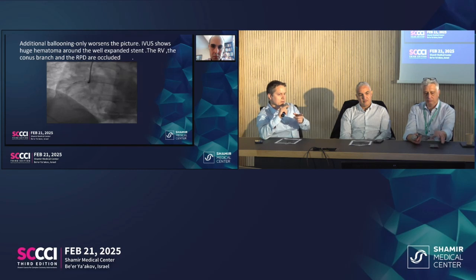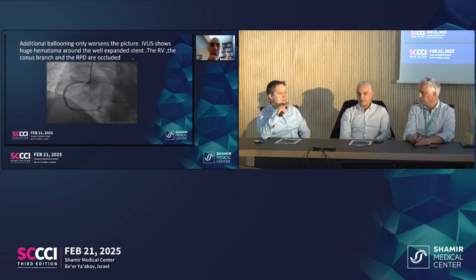There's at least one picture, it looks very hazy, it looks like a thrombus, but also there is a physical compression of the artery from the hematoma. This is not just a microscopic process, it's an actual mechanical compression of the stent, I think. And would you have felt safe to do a DCB in this case?